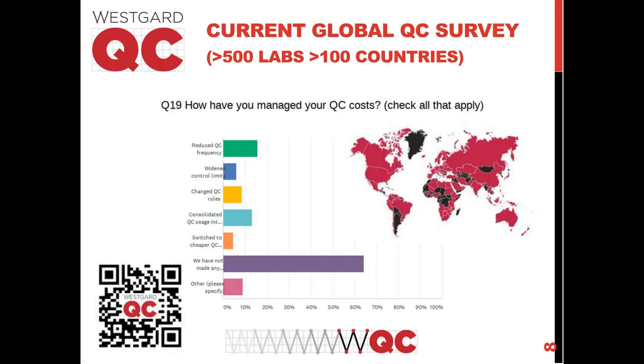And now let's take a look at the current global survey that we're running, and we have more than 500 labs in more than 100 different countries. And here the finding is, not so many people have changed QC rules, less than 10%, and almost 2/3 of labs say they haven't made any changes in how they do QC.